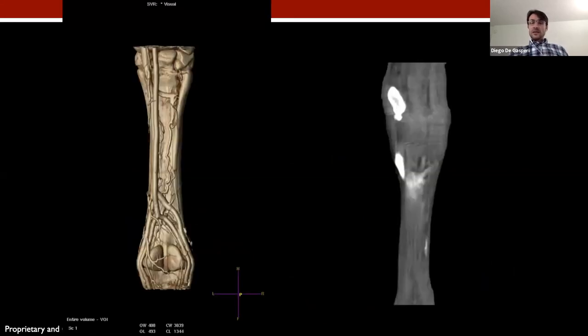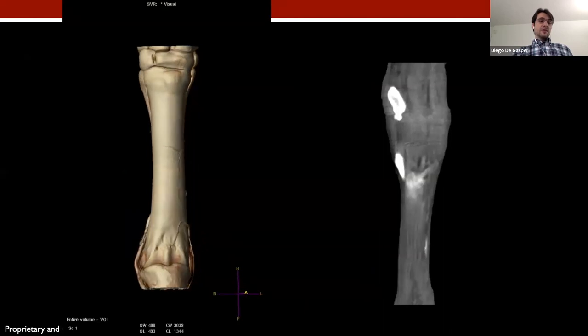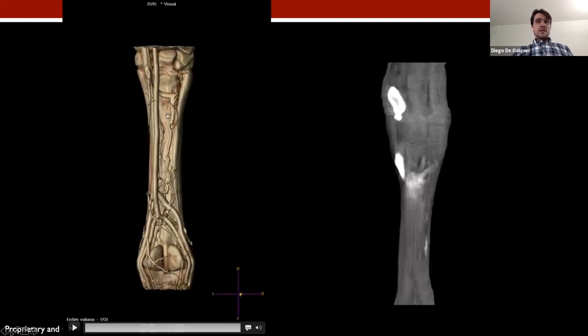We also started to look at the use of intravenous contrast. This is just an example of a case. This horse had a lesion in the proximal aspect of the suspensory ligament. The video on the left is a 3D reconstruction of a venogram. At the time this image was acquired, this horse had a tourniquet above the carpus. And the image on the right was acquired after the tourniquet was removed. So again, the contrast was injected in the vein, and we notice contrast enhancement in the proximal suspensory ligament of this horse after removing that tourniquet and re-imaging the horse.